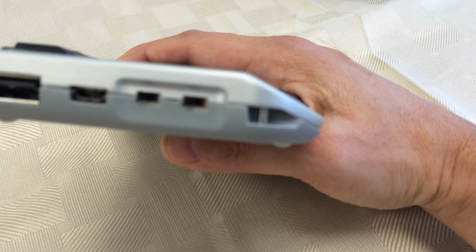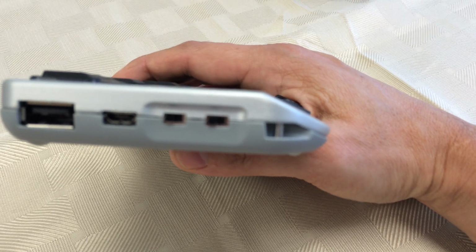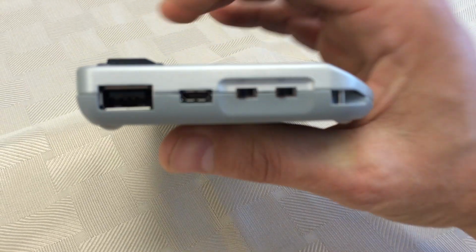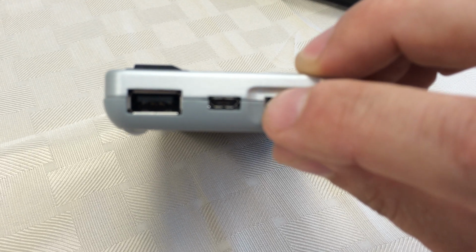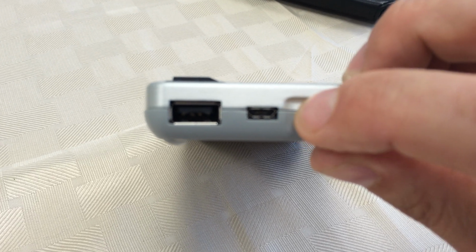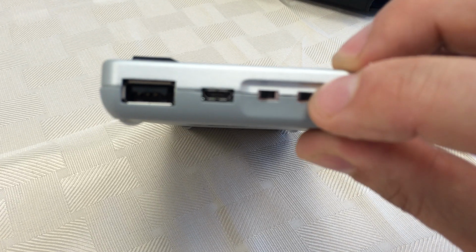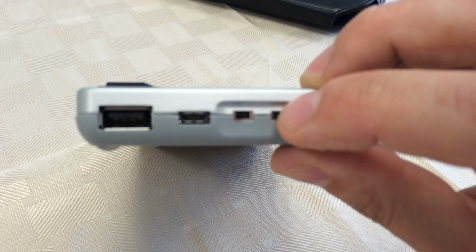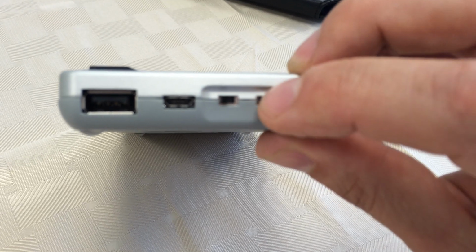There are then 2 slider controls. The one that's furthest away from the front, in this image, it would be the one that's now to the left of us. I'm going to just point for those of us that are sighted. So this one here, right now it's facing towards the back, which means that we're in note-taker mode. If I was to slide it towards the front, we then go into Braille display mode. And then the next slider is to lock the keyboard. So if you are traveling, perhaps you're reading something as you're traveling and you don't want to run the risk of hitting a key and doing something, just lock the keyboard.